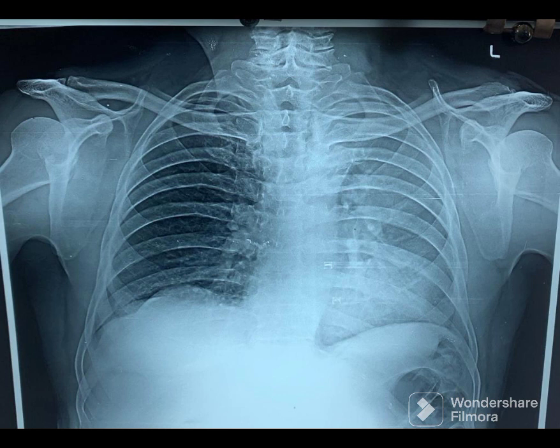In summary, the chest x-ray shows left upper lobe collapse. Thank you.